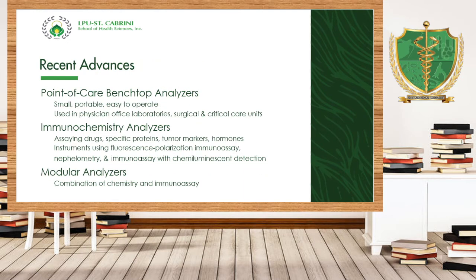So what are the recent advances in the field of automation and the field of chemistry? We have the point of care testing or the benchtop analyzer. I asked you a question during our synchronous session if there will be an effect on the manpower if all of the patients will use the point of care testing, the POCT, because POCT can be done at the bedside, no? Yun ang napag-usapan natin. Example nga nung pinag-usapan natin is the use of glucometer.